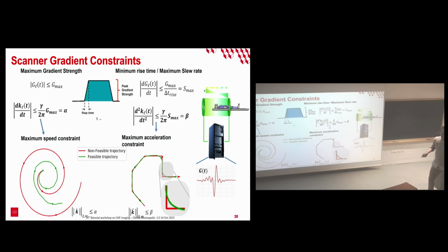This is exactly the similarity with driving a car. Okay, you are driving a car in the Fourier space. You cannot make a very sharp turn at 200 kilometers per hour. It's impossible. So it's very kinematic. Understand this as a kinematic constraint.